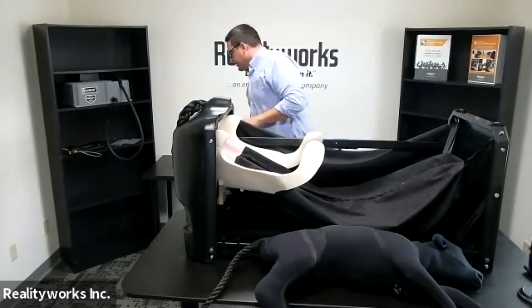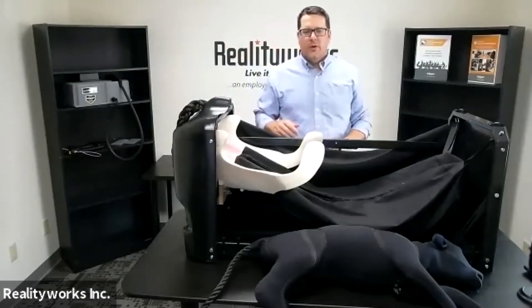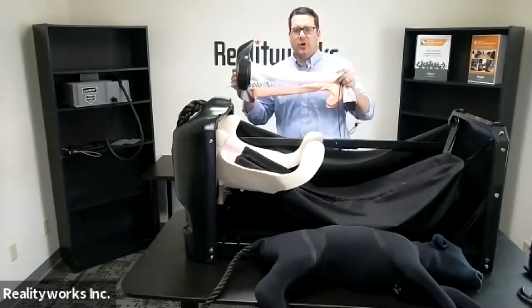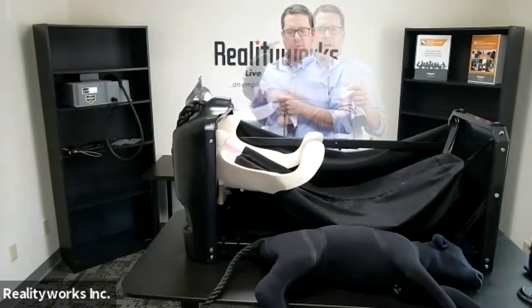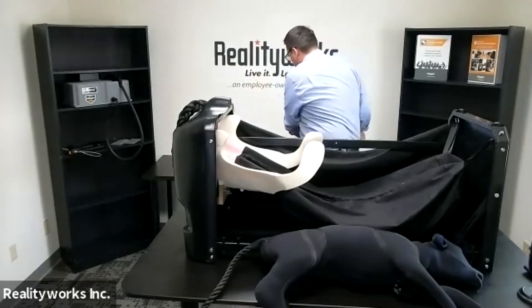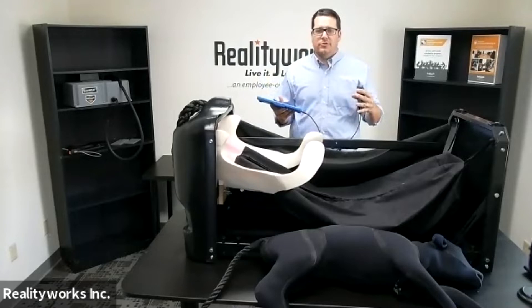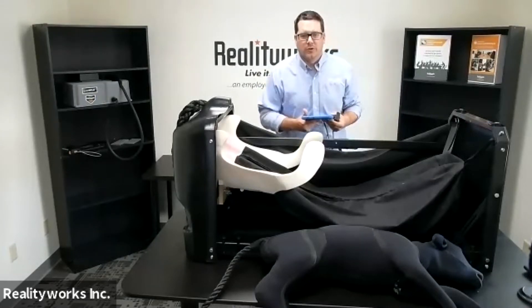Not only do we have a reproductive tract for birthing, we also have a reproductive tract for ultrasound. This is an interchangeable model where you can switch out and put in a different reproductive tract for ultrasound. The ultrasound product also comes with an ultrasound tablet and a probe, so as you're doing ultrasound you can visually see what you're doing.